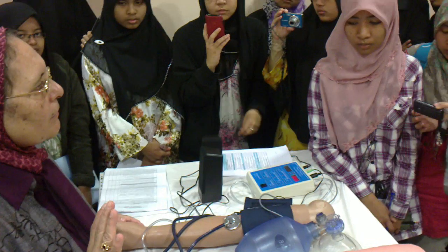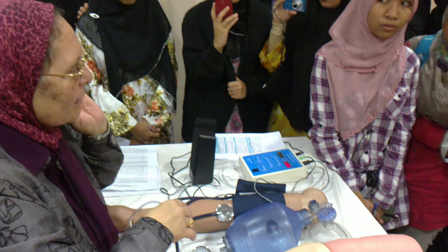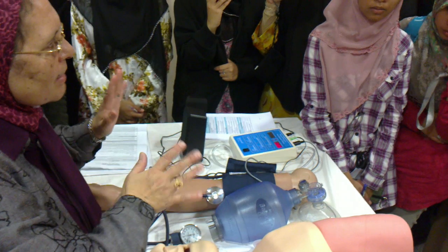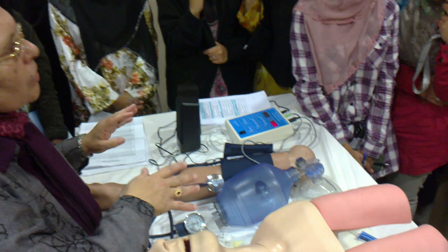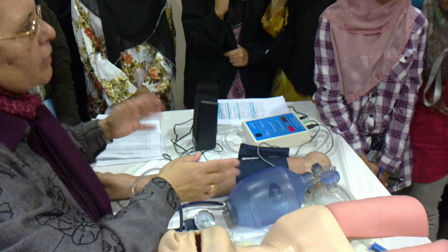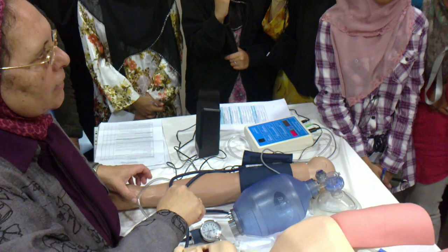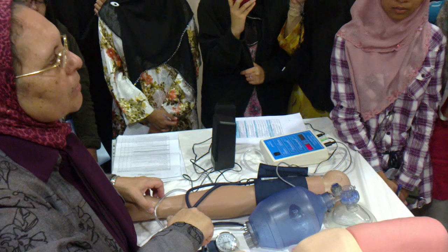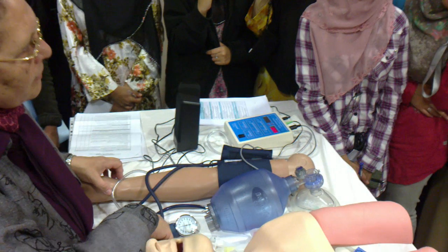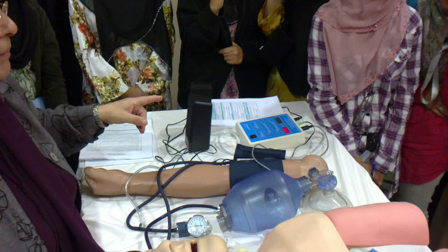Okay? We may change it between skills. Please say what you are hearing. Okay? This is how we measure the blood pressure. If you are asked palpatory only, or if it is measure only, you have to do palpatory and auscultatory, and tell the examiner palpatory 150, auscultatory 140/80. Okay? This is how we do. Okay?